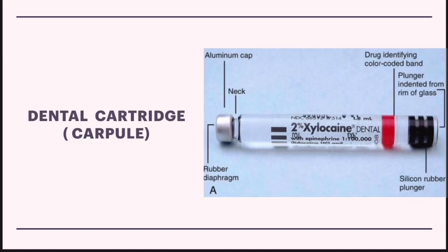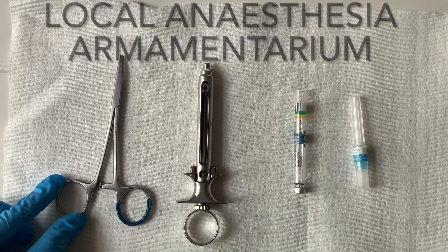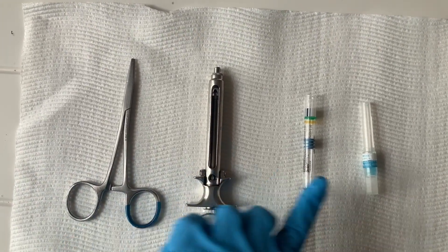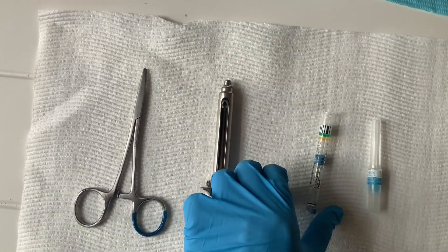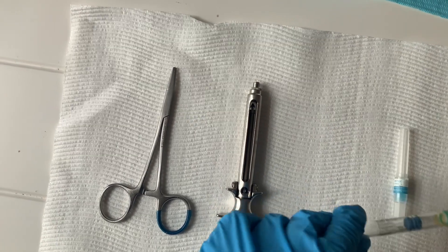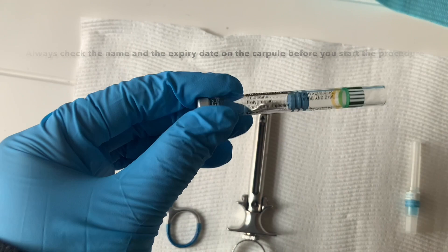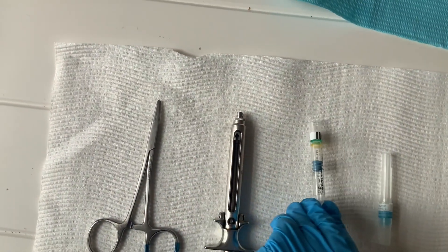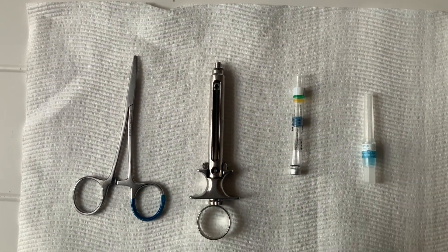Next is the dental carpule or dental cartridge. We have our forceps, local anesthetic syringe, local anesthetic carpule, and needle. Before we start, we have to make sure we have the correct type of local anesthetic cartridge or carpule we want to use, and also we need to check the expiry date on the carpule.